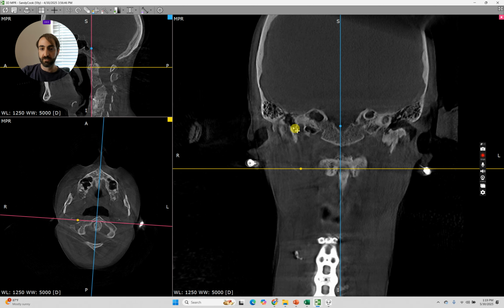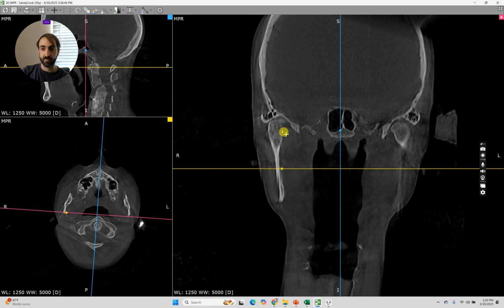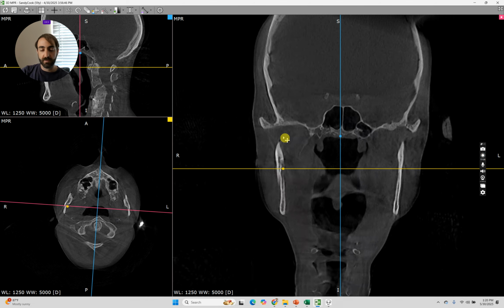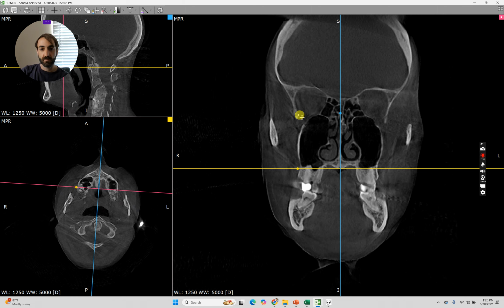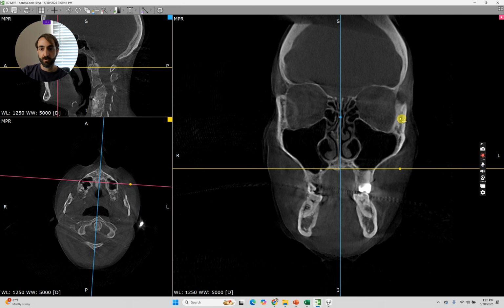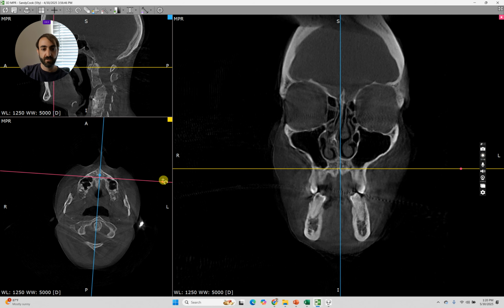Or that internal ear canal is what I mean. And then do the jaws appear at the same time? And people could have jaw misalignments that affect that. So I don't put all my money on the jaw, but then here on the eyes, do these orbits come in at the same time? And no, not even these come in together. So I'm just going to try to even this out a little bit.